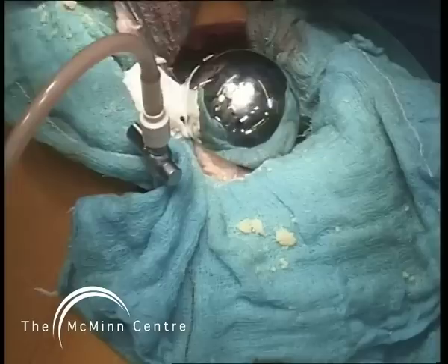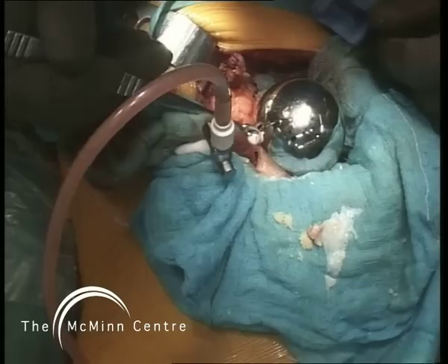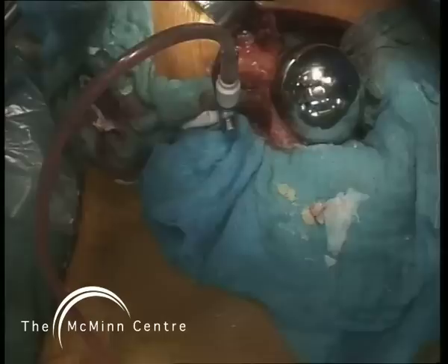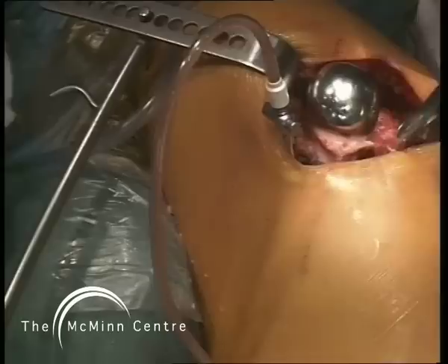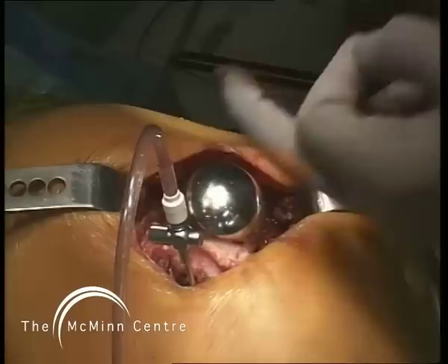You can still see lots of fat and marrow pouring out of the femur. We've shown that this venting markedly reduces our incidence of fat embolization into the systemic circulation, confirmed by checking with transesophageal echocardiography. I'm now removing any osteophyte at the periphery at the head-neck junction, taking care not to remove soft tissue from the femoral neck, because devascularizing the femoral neck is another potent cause of femoral neck fracture.